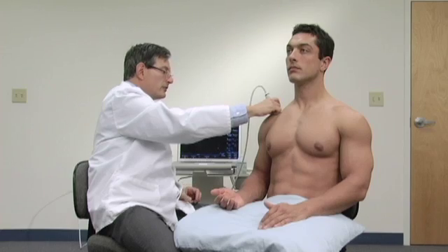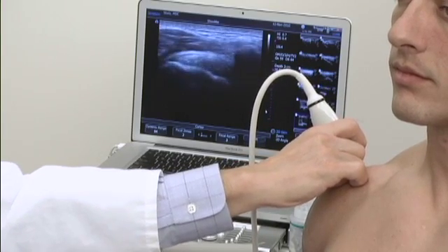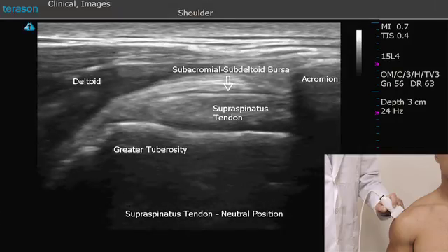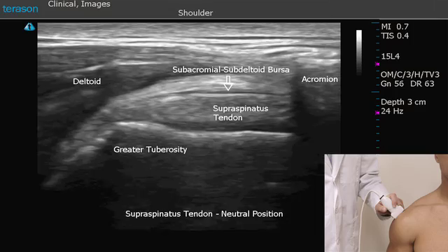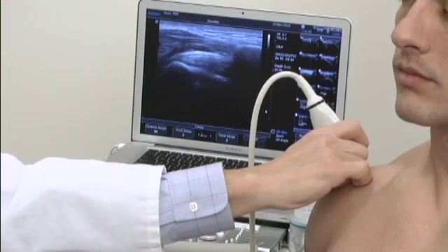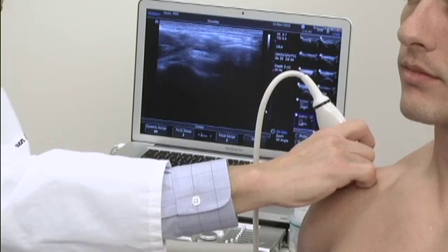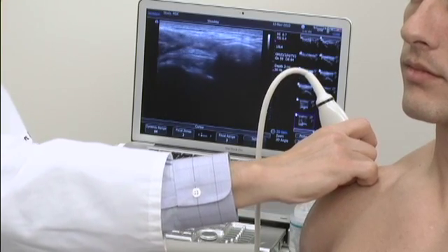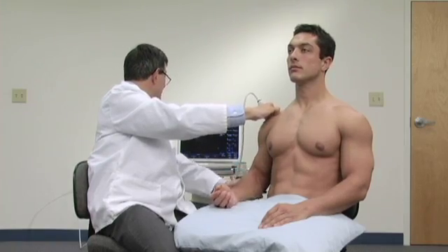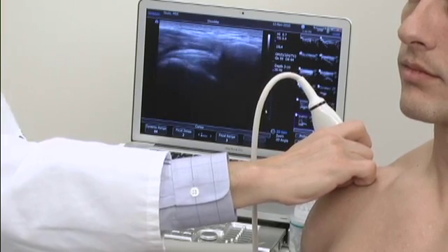From this position, I'm going to slide the probe laterally and we're going to look at the supraspinatus tendon in its neutral position. This is not the position that we use to evaluate the supraspinatus tendon typically, because we only see a small portion of the tendon. As we raise his arm up, you'll see the movement occurring between the bursa and the tendon below it — there's actually the movement between the deltoid and the supraspinatus tendon.